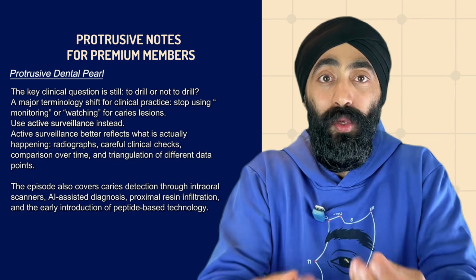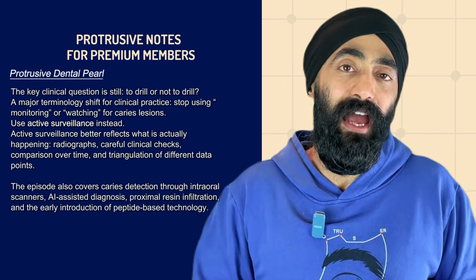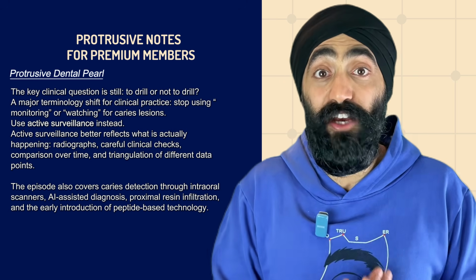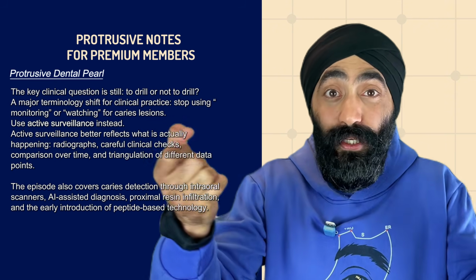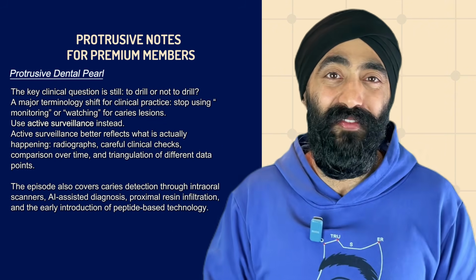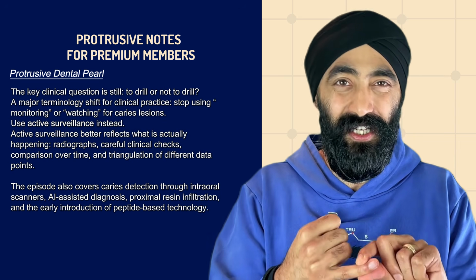As a patient, when you hear monitor versus active surveillance, it means 2 different things. And the term better reflects what we actually do. We take radiographs, we check extra carefully clinically, we triangulate all the data, and you'll hear more about that in this episode. We also find out if the caries detection in the intraoral scanners is any good.